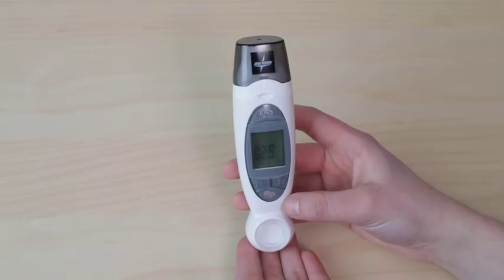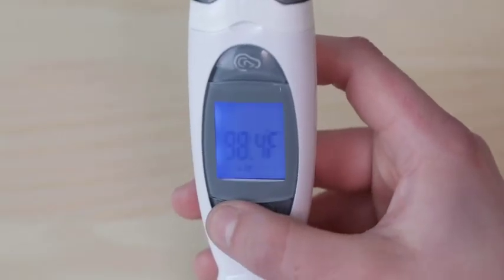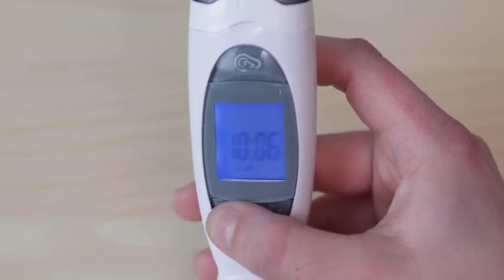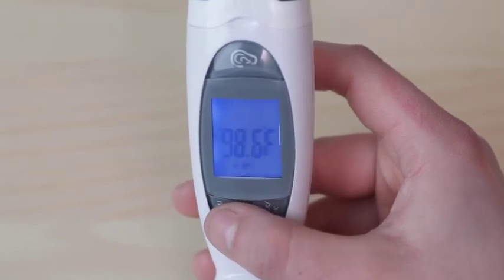This thermometer can recall the past nine measurements. Press the memory button to check the memory number, temperature, and date. Press this button repeatedly to switch between the nine stored readings. The screen will cycle through the date, time, and temperature for the chosen measurement.